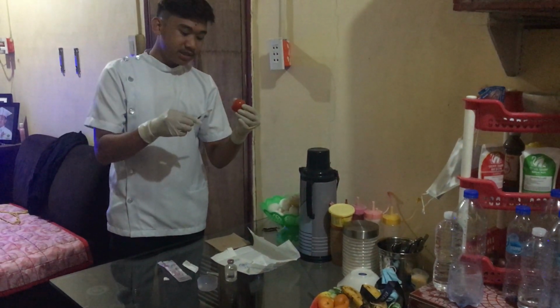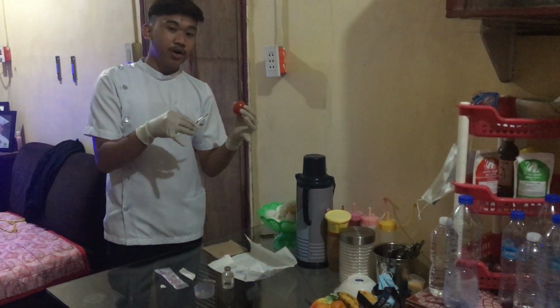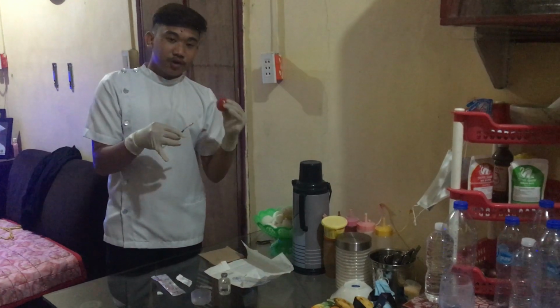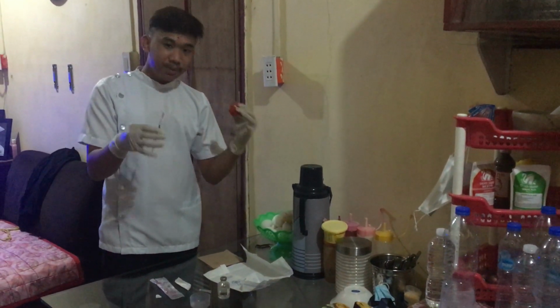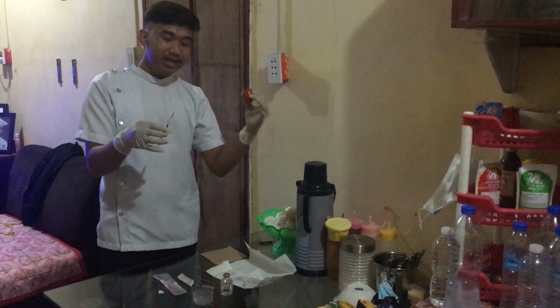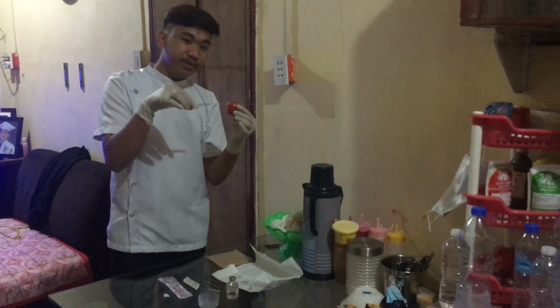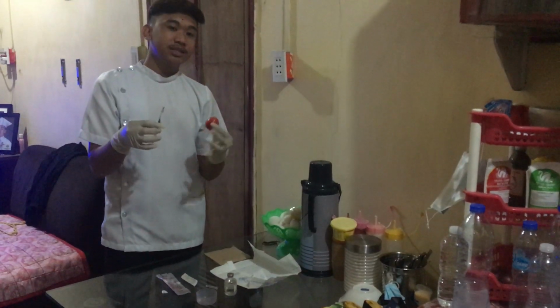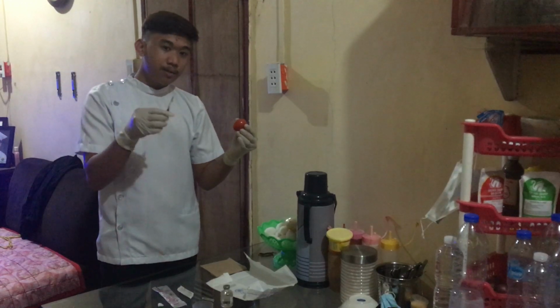and then at 45 degrees, you're going to inject at 45 degrees, or if your patient is fat or a big guy, it is okay to inject at 90 degrees. But in my case, it is just a normal body shape, so I'm going to inject at 45 degrees.